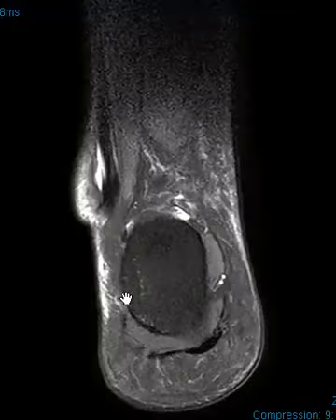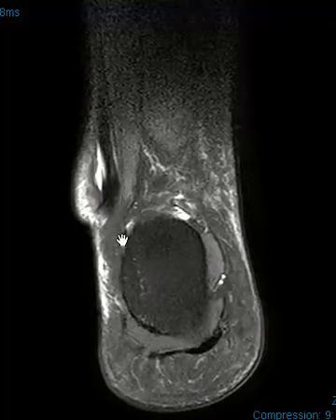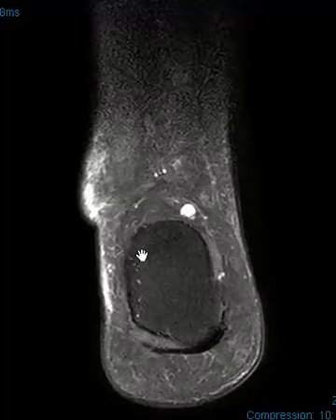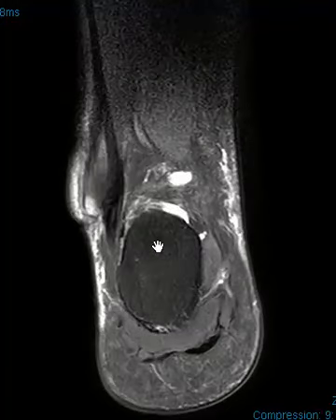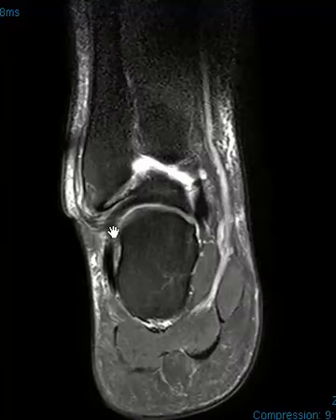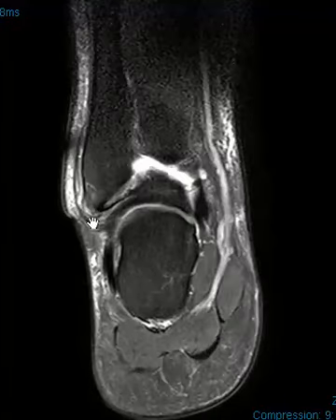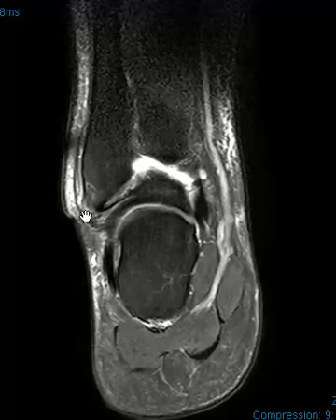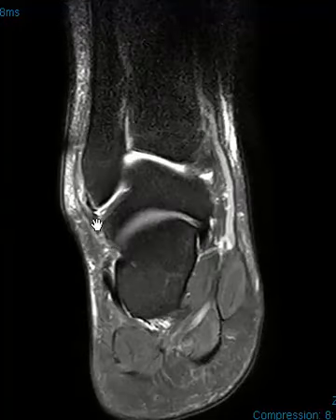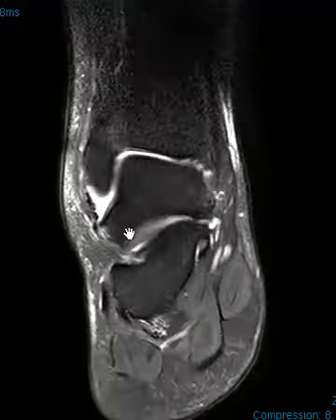Now let's look at the calcaneofibular ligament on the coronal images. This is the calcaneus — posteriorly, that little dot there is the calcaneofibular ligament. We go backwards, now we go forward — there it is, forward, trapping underneath the peroneus tendons — and we'll go forward. If you see down here, it's pretty far away from the tip of the fibula, and you can see the periosteum is pulled off the fibula here. So there's a separation between the fibula and that calcaneofibular ligament — it is also torn.